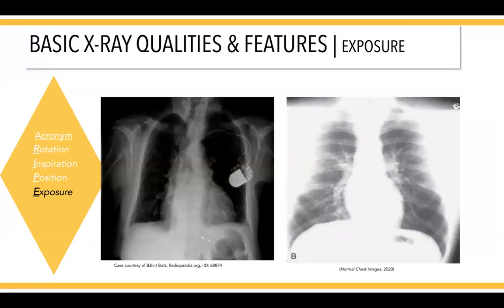Note image exposure and quality by assessing the opacity and brightness of anatomic structures. The image on the right is underexposed. Anatomy in underexposed images appears bright white or radiopaque. Note the lack of identifiable thoracic vertebrae in the chest X-ray. Conversely, the image on the left is overexposed. Overexposed chest X-rays appear dark or radiolucent where the rib structures should be. In these chest X-rays, the vertebrae are usually more defined than in images with optimal exposure.